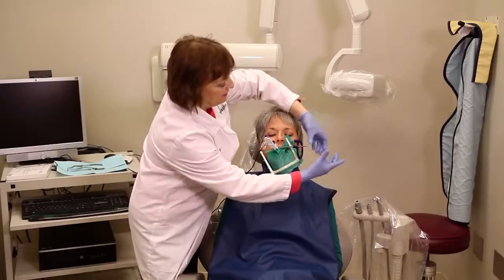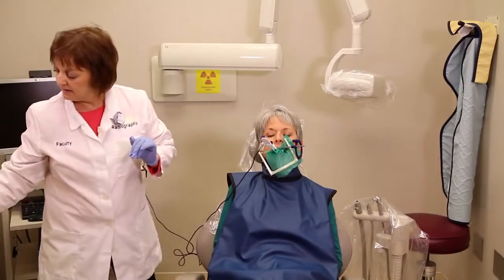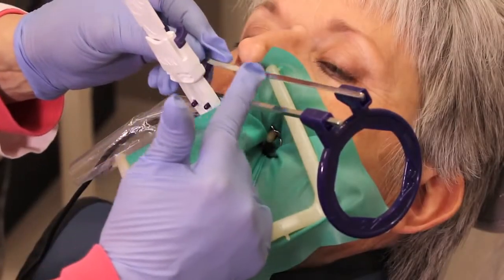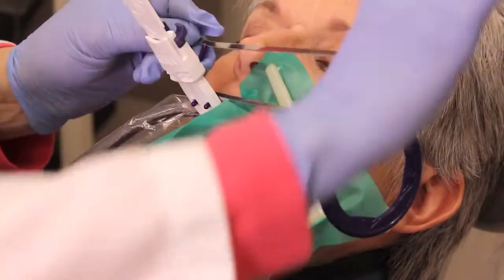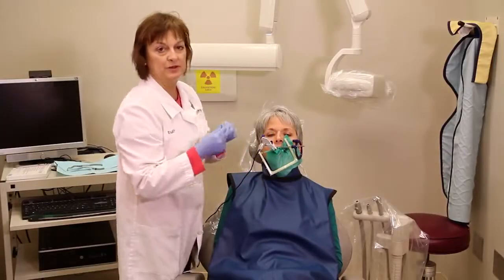You bring your tube in and align the bar. Many times when you're doing a tooth up there you miss the root tip. So what you want to do is use one of the angled bars that come with the kit and place that in instead. You can see it's got a 15 degree angle upward to actually bring your vertical tube angle a little higher, and this will be able to include the root tip for sure.